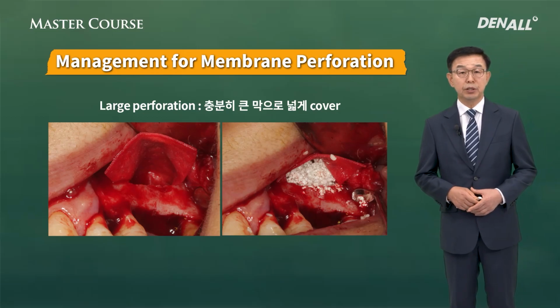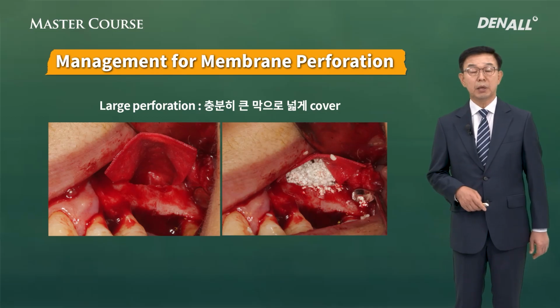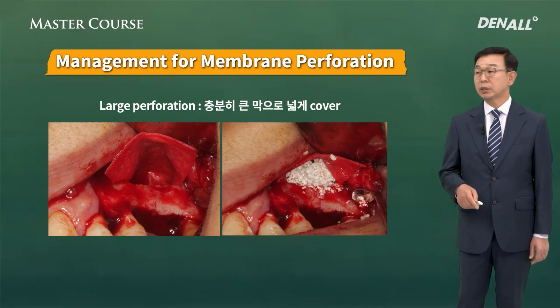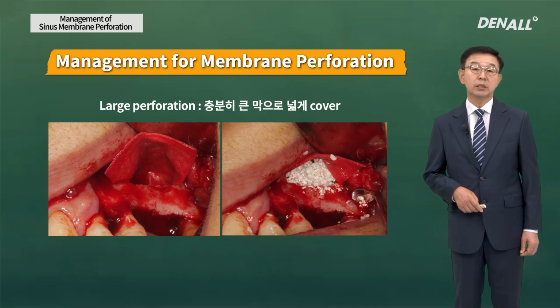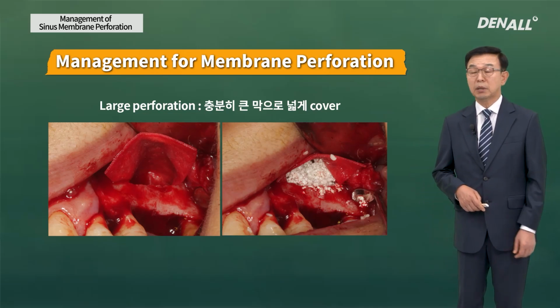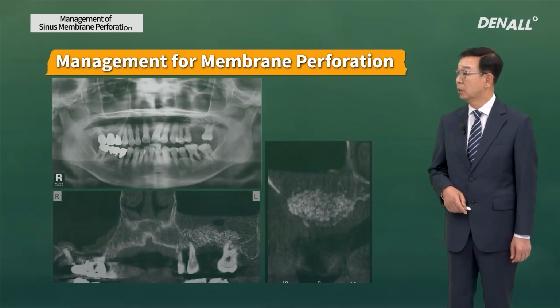If there's large perforation, rather than doing bone graft and implant placement at the same time, it is better to do bone graft and wait. Wait for more than 5 months and place the implant in secondary surgery. I think that is the safer way.